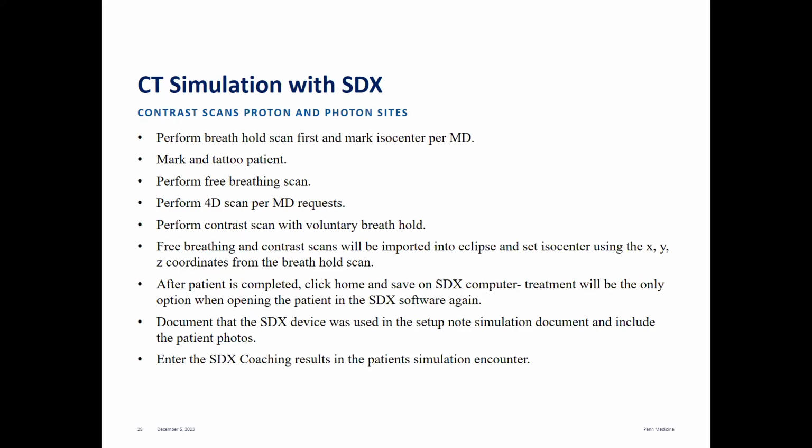So you want to make sure that you take out all of the SDX parts from them. You don't want the mouthpiece in or the nose clip on, just in case the patient did have a reaction to the contrast. You want to make sure that they're able to call out to you or get your attention. So if they had the SDX mouthpiece in and everything, it would be hard for them to get your attention. You're going to import that free breathing and the voluntary contrast scan into Eclipse, setting the isocenter with those same coordinates from the breath hold scan, the X, Y, and Z coordinates.